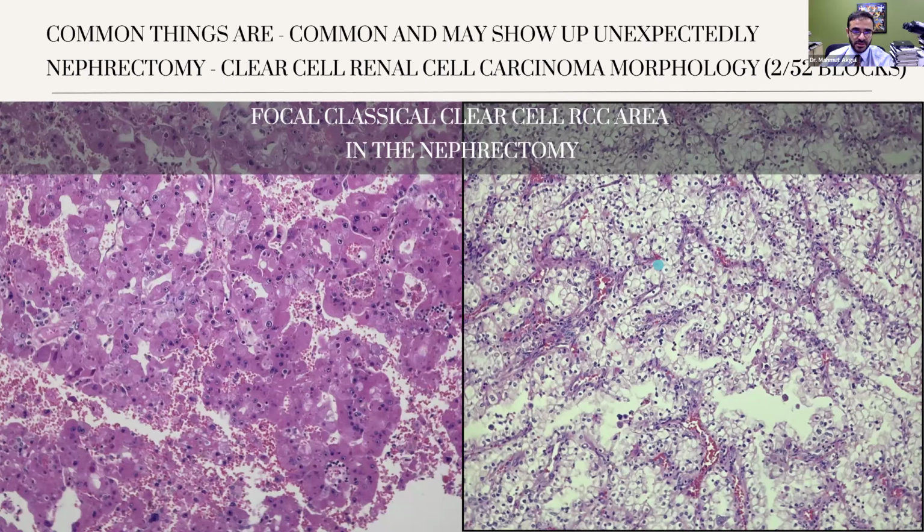As I told you in the beginning of my talk, sampling, adequate sampling, liberal sampling is sometimes more important than immunohistochemical assays.